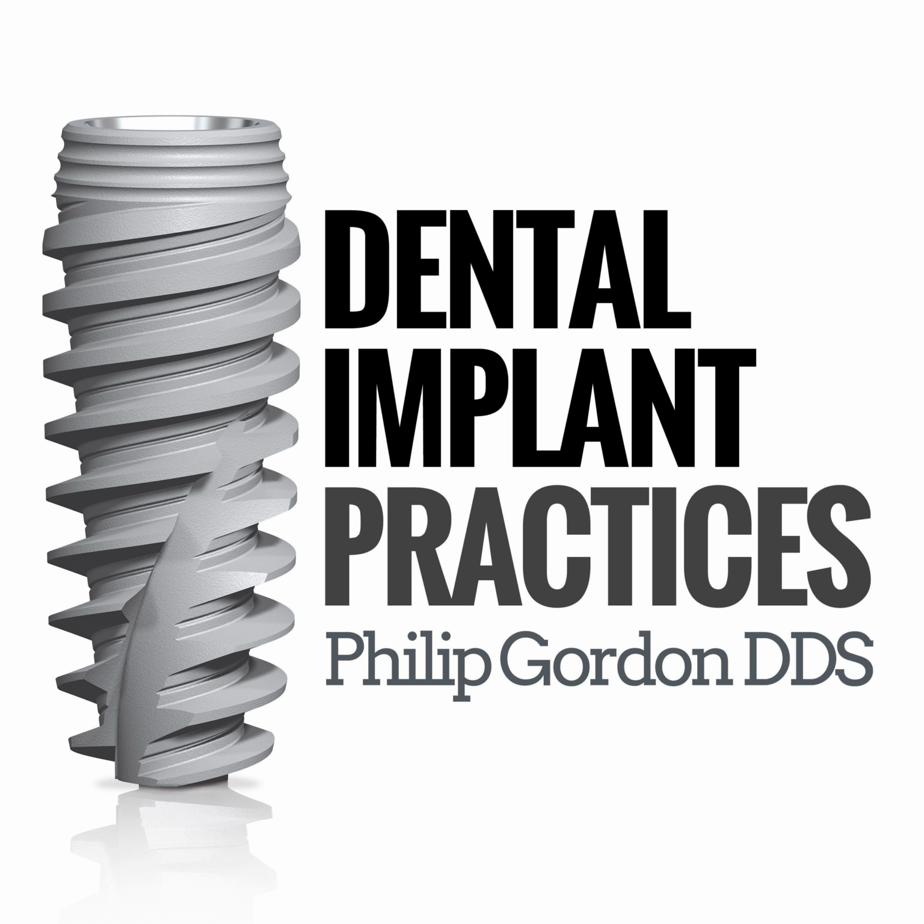The Locator abutment systems: the patent has run out on the traditional Zest Locator attachment. So each company can now offer their own Locator abutments, and a lot of people are making those. That's the most common type of removable implant overdenture. So there are just lots of choices when it comes to an implant system.